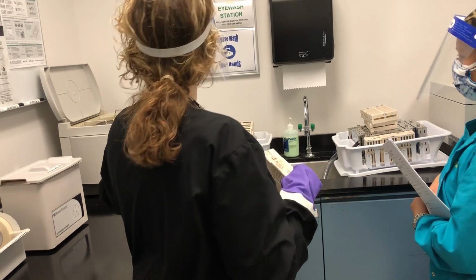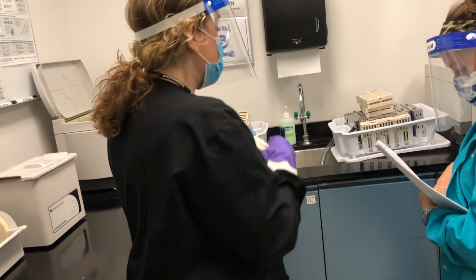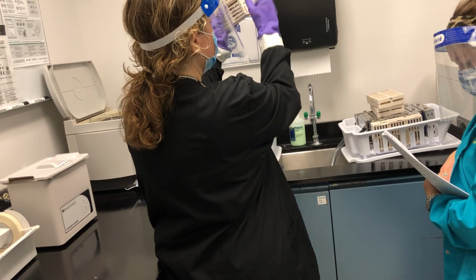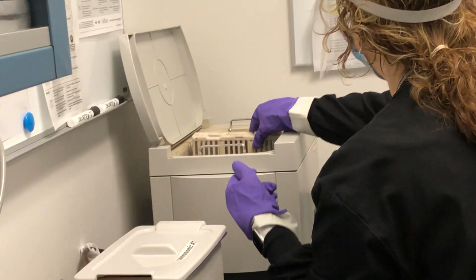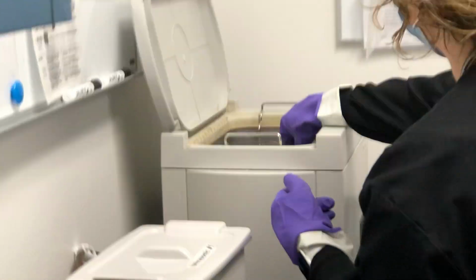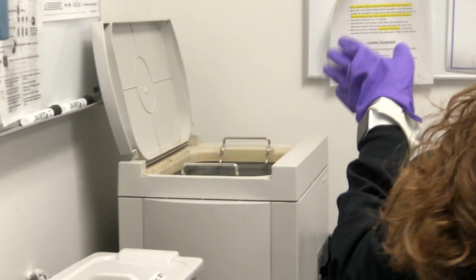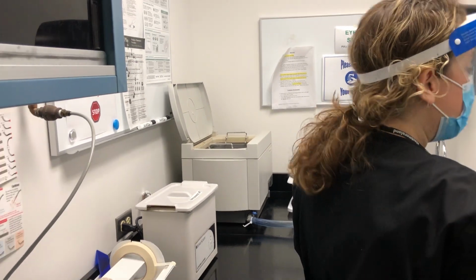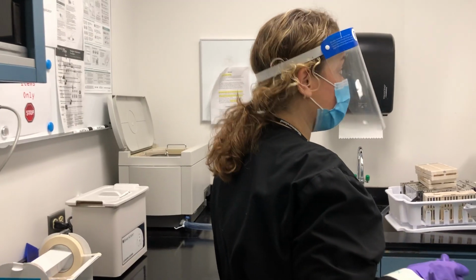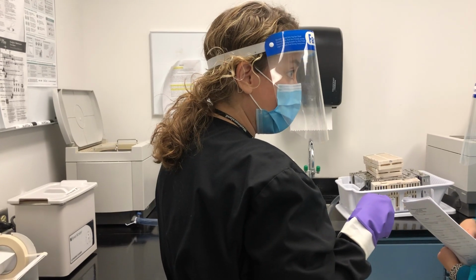And then, does everybody remember the Biosonic? You have to make sure that the water levels are appropriate. So when you put it down in, you put it down with the little nuts facing up, and you drop it down. There's a metal rack in here that has little slots, so you just wiggle it down in until it sets. I would let everybody peep in there, but you'll just have to take my word for it. It is covered by water right now. If by the end of the day we end up with less water, you may have to get down under here with the little jug of water and fill it up some, okay?